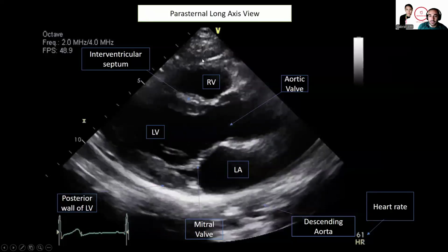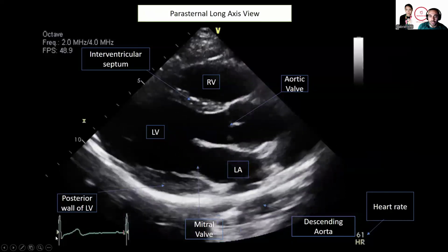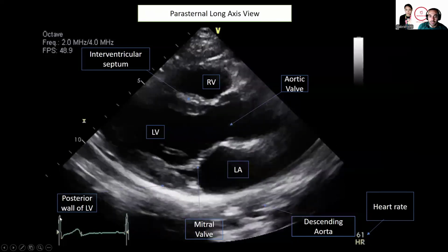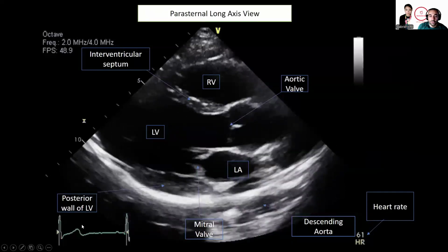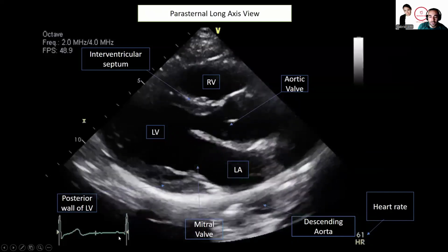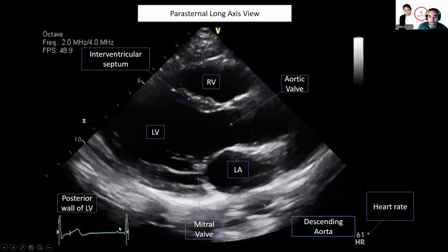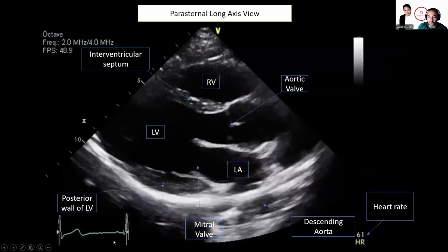The other things that we can see on this image is here the heart rate for this particular patient and the ECG tracing. We know that the QRS often falls when we are at the peak of diastole, and then eventually systole, or the peak of contraction, will typically appear in that area, and then eventually you get relaxation and then you get full diastole back at the onset of the QRS just before activation or the electromechanical activation.